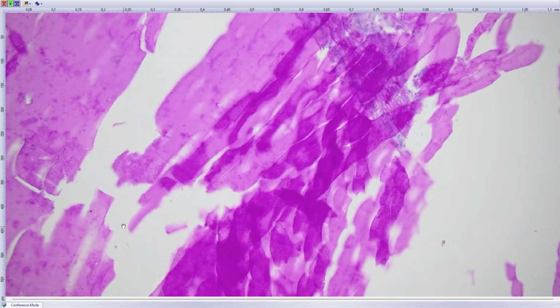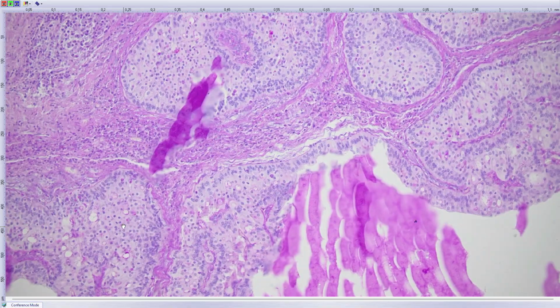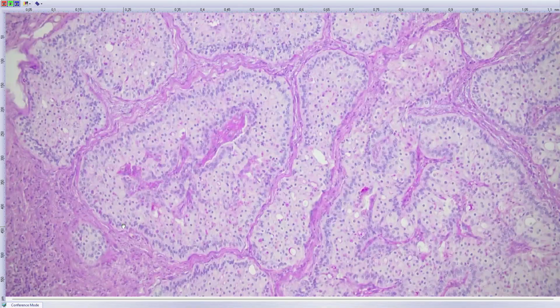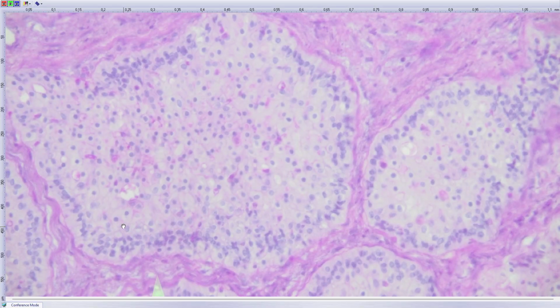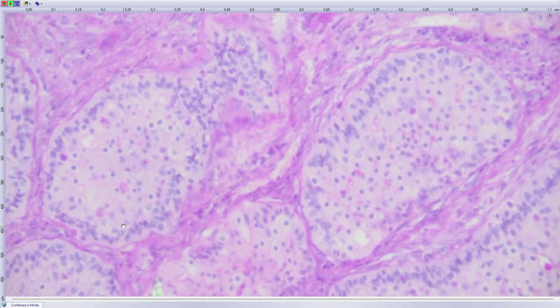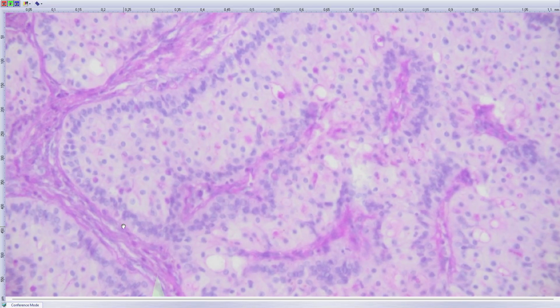Here is the PAS staining, which shows the reverse polarity even better. Yeah. Look, you see the reverse polarity. So if you would see anything like that. But similar tumors are also in the breast, right? Yeah, in breast as well. Yeah. And thyroid too? Thyroid not, no. Thyroid not, yeah.